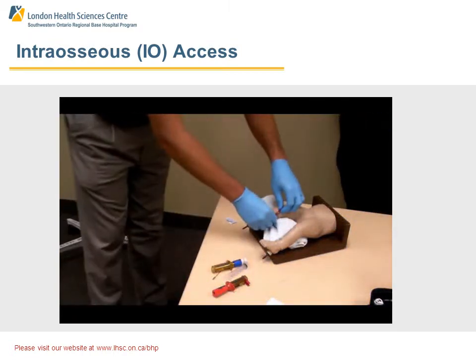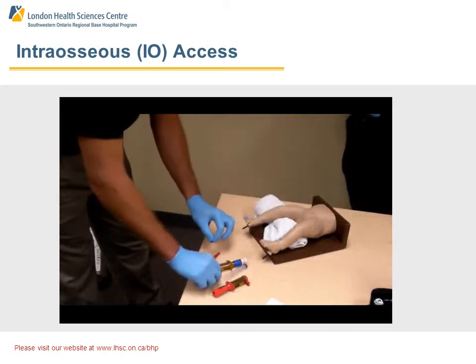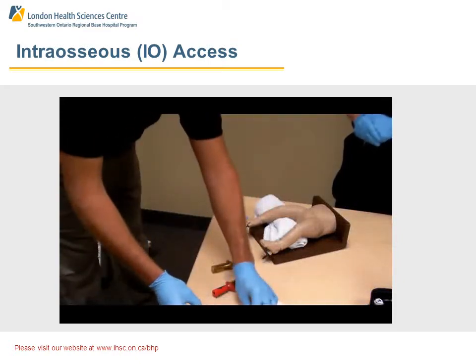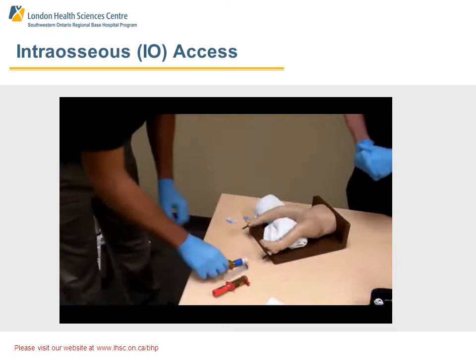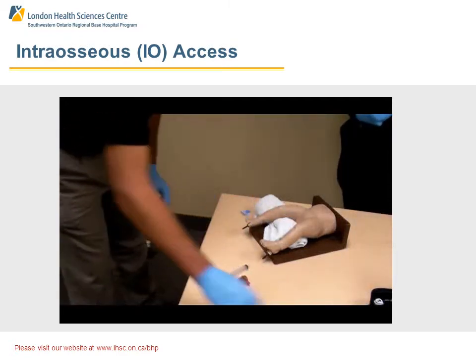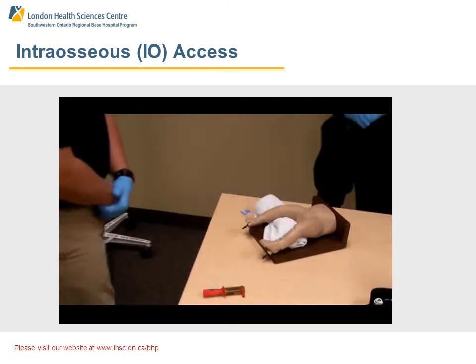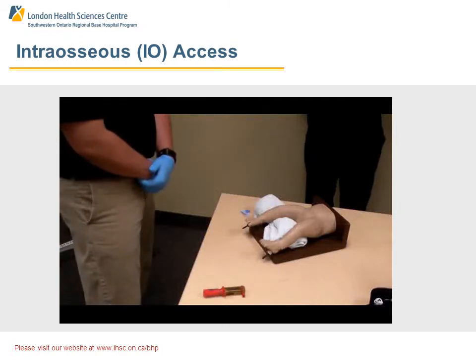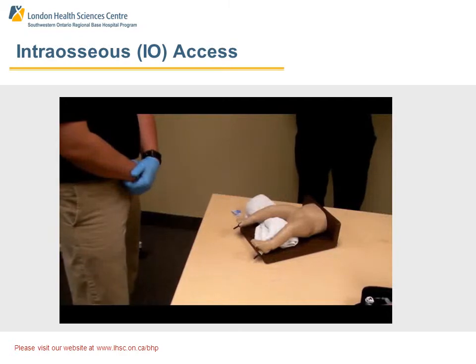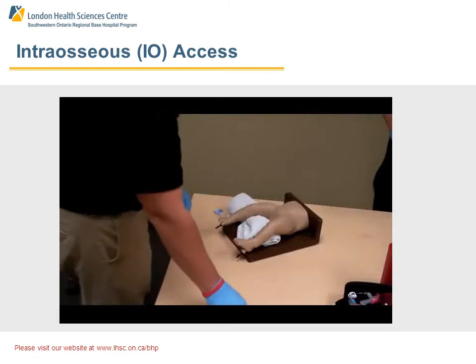It's a nice, simple technique that can be done pretty quickly. The problem with this device is that it's potentially dangerous — once you pull the firing pin, as Pete noted, it's live and the gun will fire with some force. Lastly, we'll get Dwayne to demonstrate the Easy IO drill, which uses a different mechanism for inserting the needle and can be done very quickly.